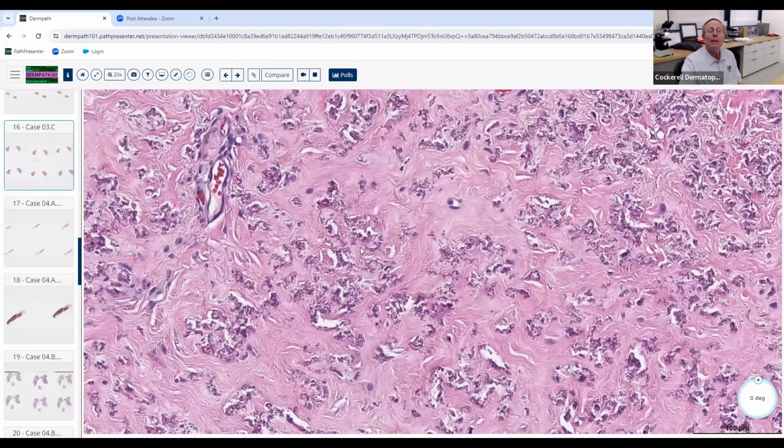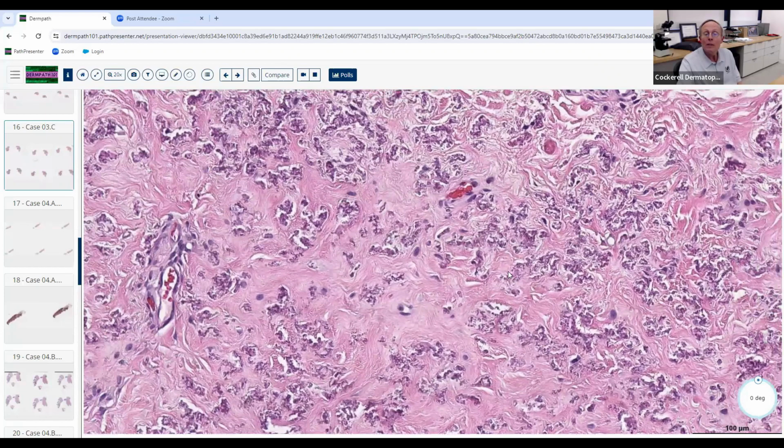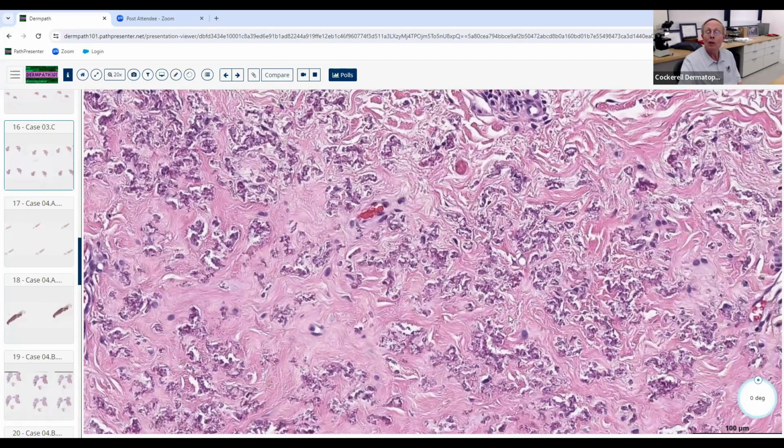The other type is due to penicillamine ingestion. And you can't really tell here because we can't get high enough with just this slide scanning. But if you look really hard at the elastic fibers that are calcified, the ones that are penicillamine-related, they have the so-called bramble bush morphology. If you look carefully, you'll see an elastic fiber with a little nubbin that comes off at 90-degree angles. And if you see that, it strongly favors penicillamine-induced PXE.